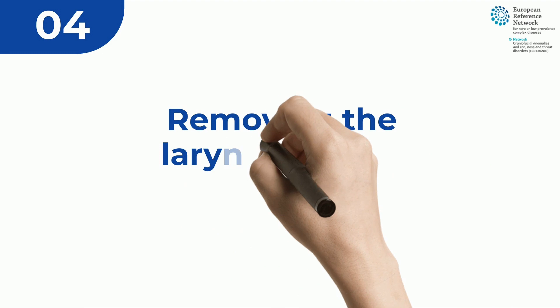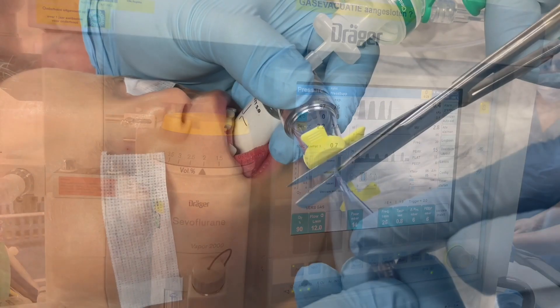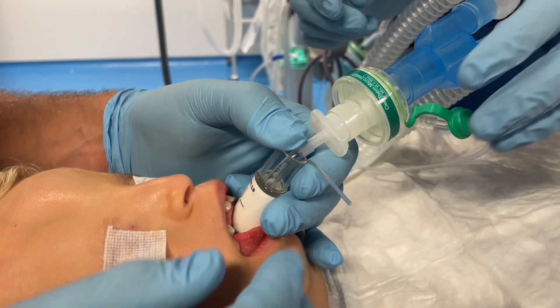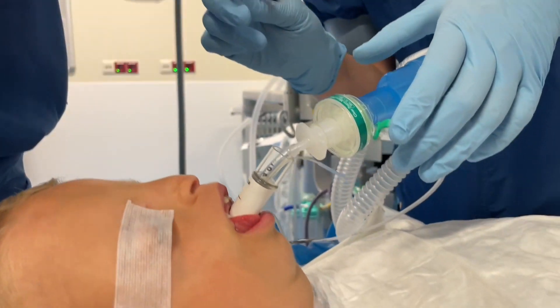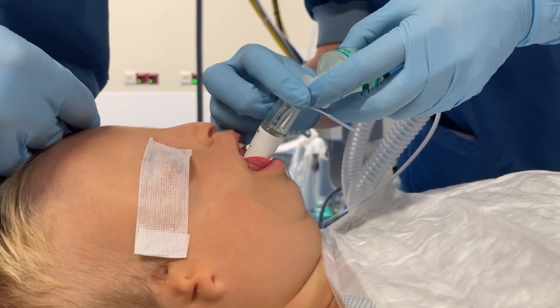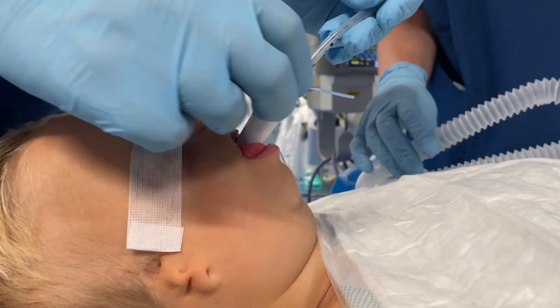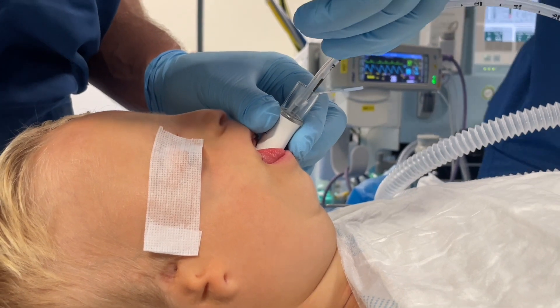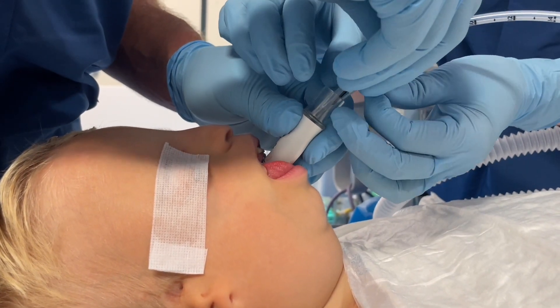After adequate ventilation through the endotracheal tube is confirmed, a second tube with a smaller size is placed on the endotracheal tube in order to maintain its position when removing the laryngeal mask. In order to remove a pediatric size laryngeal mask, the cuff needs to be cut. Hold the tube in place and gently remove the laryngeal mask.